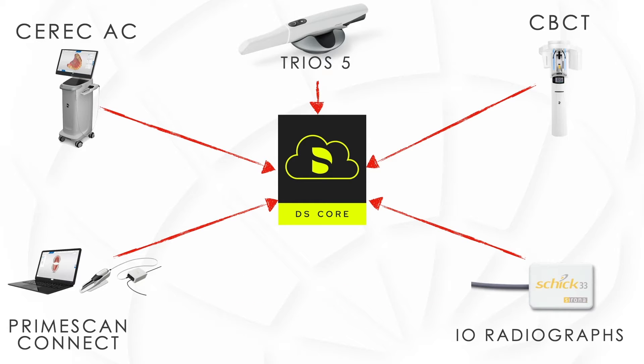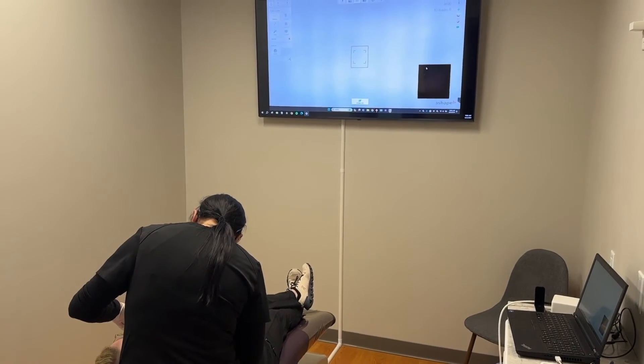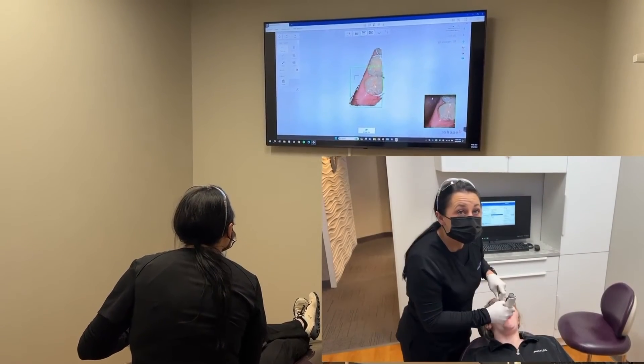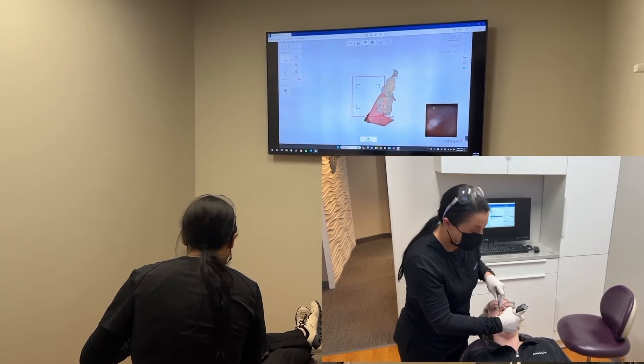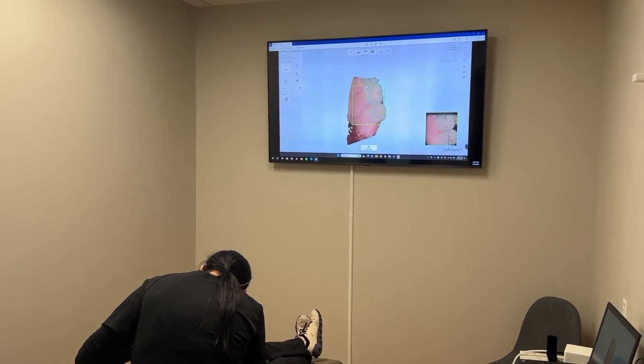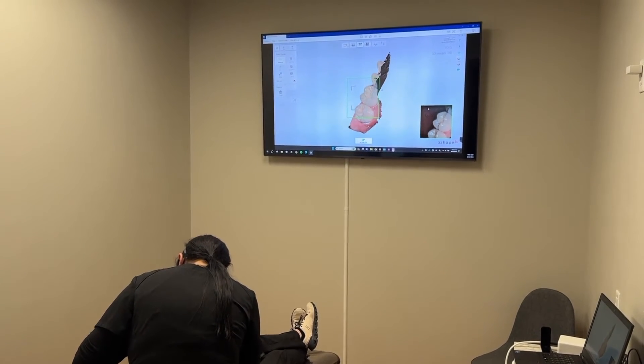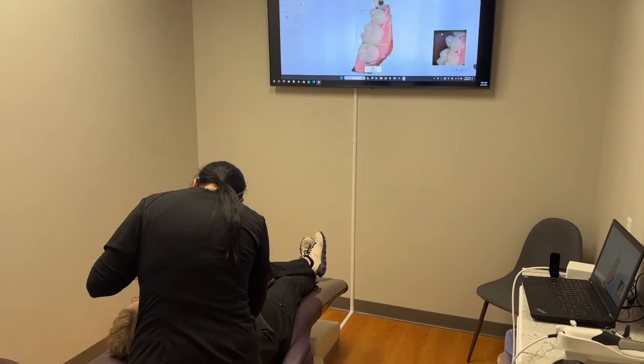The new collaboration between 3Shape and Dentsply Sirona allows all TRIOS scans to automatically transfer to DSCore. This benefit allows current CEREC users to implement an additional scanner into their chair-side workflow, and existing TRIOS users get access to Dentsply Sirona's best-in-class integrated milling and printing ecosystem. Here's my dental assistant using the wireless TRIOS 5 scanner in our consult room.